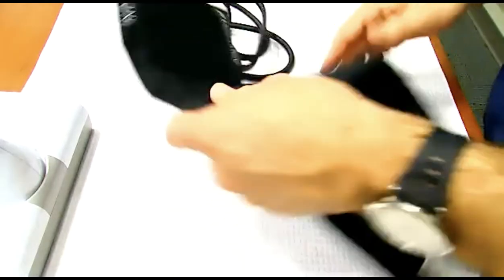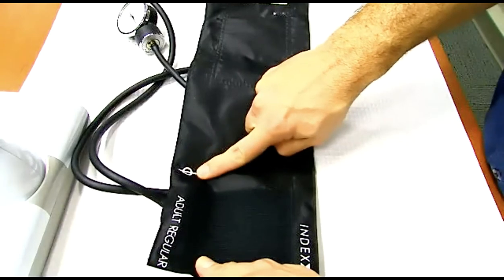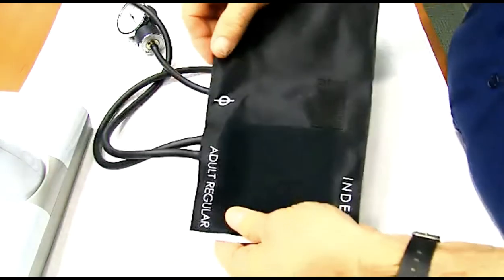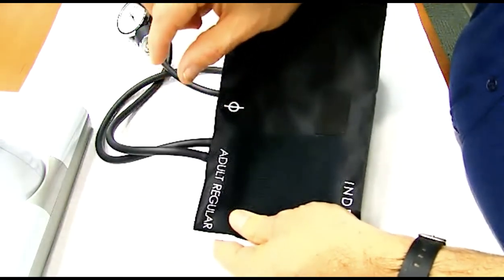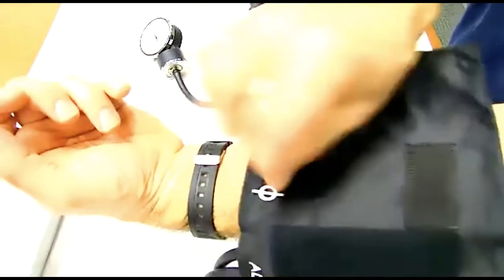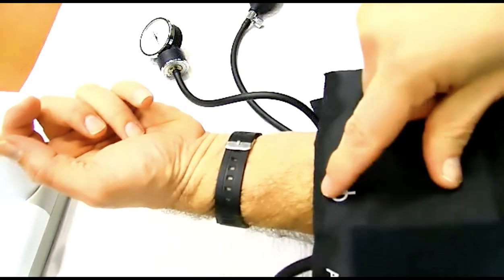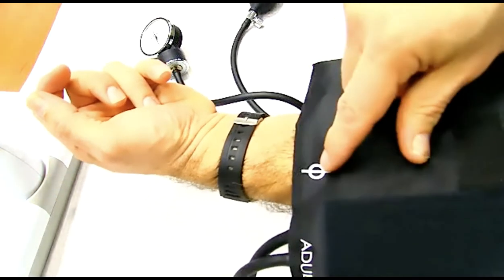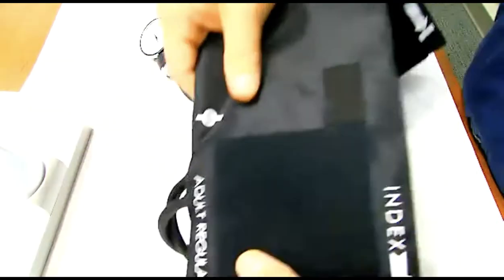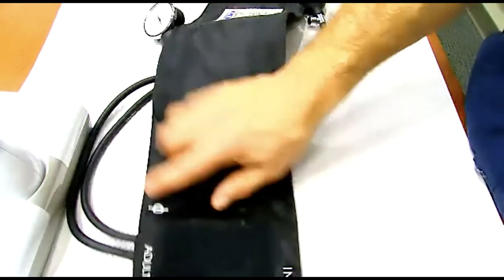So let's start here. The marking you need to start with, the most important marking to orient everything, is this circle with a line. This is the target arrow, if you will. This is going to be placed directly over the brachial artery. And I'm going to show you where that's at, but that's where you're going to put the stethoscope. That's what you listen for, right over the brachial artery. So this needs to be on the outside of the arm here, like this. This is not the right spot, but over the arm. And again, facing right where you're going to put the stethoscope. So it needs to be on the side closest to where the stethoscope is going to be, and it needs to be on the outside. And that's the marking that's going to go over the brachial artery, okay? So that's the outside of it. So that's the first marking to know. You'll notice it's just to the side of the tubes there.